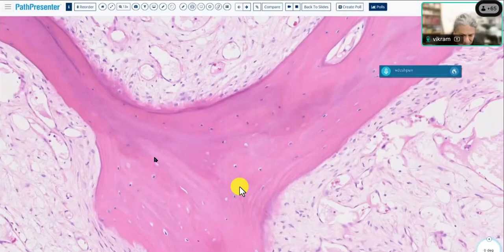And you can see that there are seams of bone. So this is a seam, here's a seam. And so these different pieces of bone have been laid on at different points of time. And I refer to this as remodeling. The osteoblasts are actually not very well represented. As the bone matures, the osteoblasts shrivel up, and perhaps that's an osteoblast. They become very small. This is bone which you can see is still growing, which is why you can see the osteoblasts, but you're not seeing them in their full glory.